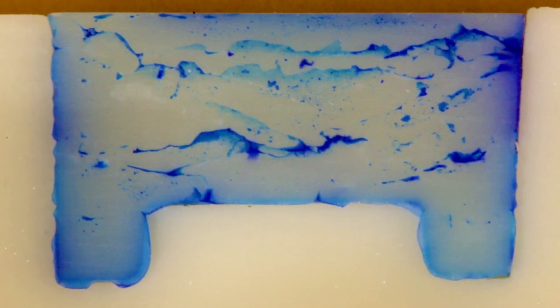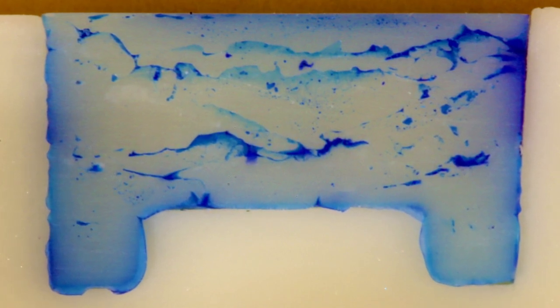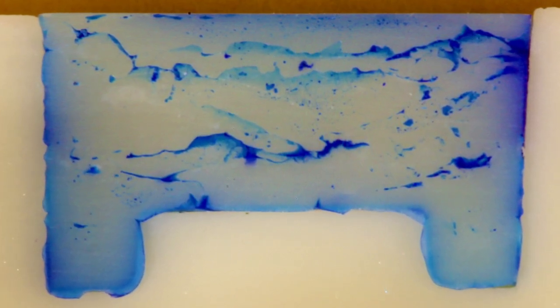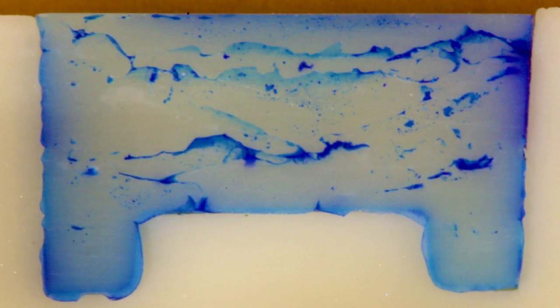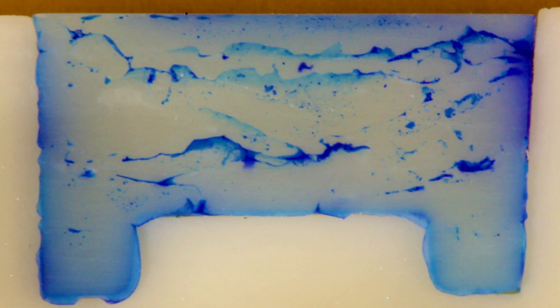Now we never knew that these knit lines were present until we started doing Micro CT or until we used this mold which allowed us to look down the side of the restoration and also at the bottom of the restoration.